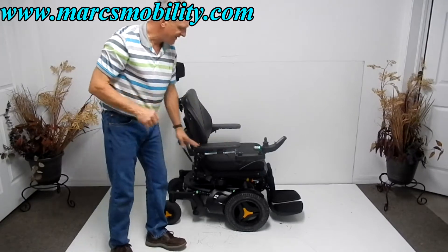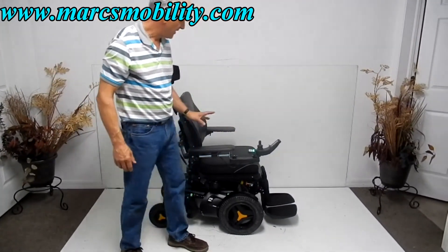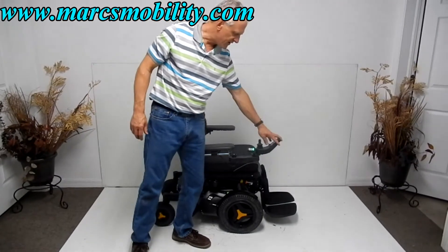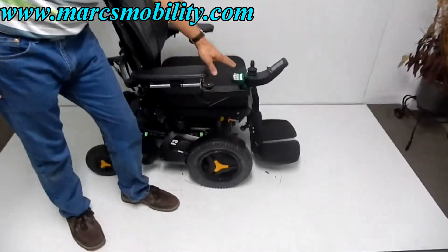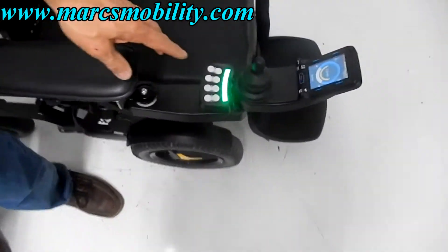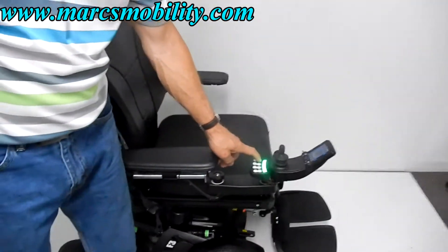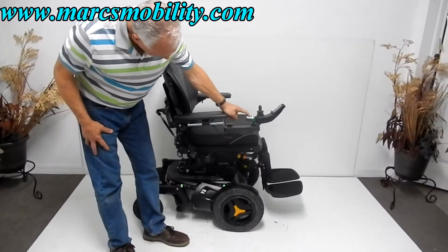The first thing I want to show you about this F3 is the electric seat lift of 12 inches. You can work the seat lift through the joystick or through the box behind here. I'm going to do it through the box — it's a lot quicker. If you just push the button here, your seat will start going up, and you can see that 12-inch seat lift going up right now.